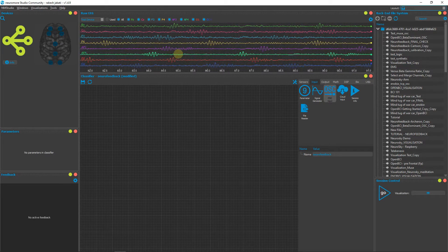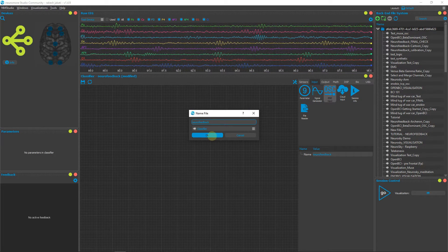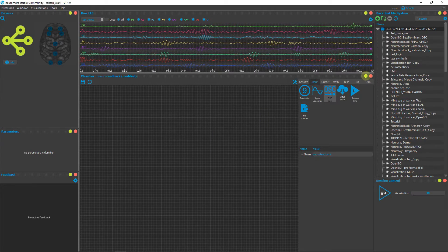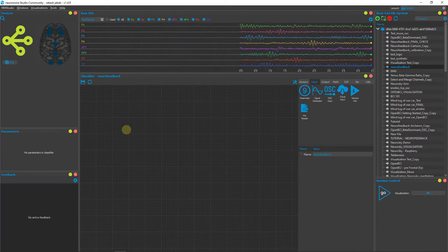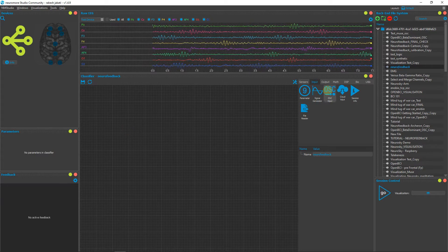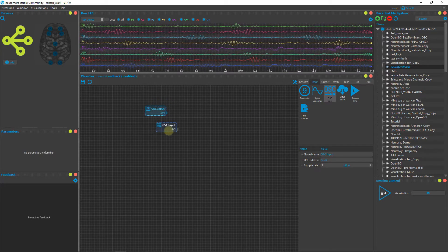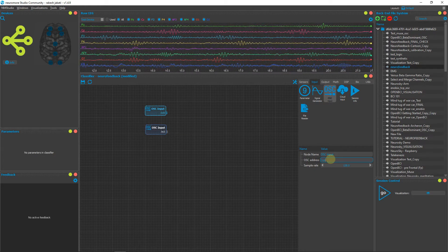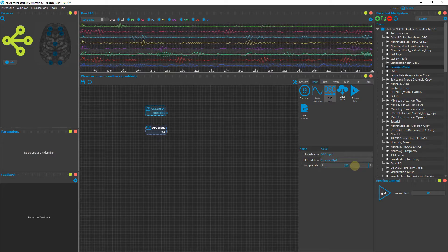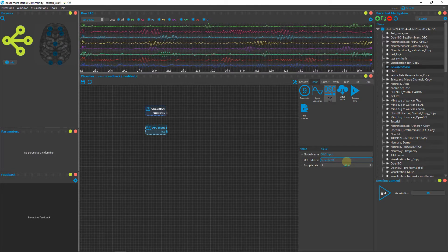To create the neurofeedback pipeline, open Neuromore Studio, right-click and create a new file called 'neurofeedback', and click OK. Open the newly created pipeline. To get data from the OpenBCI board, we use Open Sound Control — drag two OSC inputs from the input tab, as we are using two electrodes FP1 and FP2. Change the address of the first node to slash OpenBCI slash FP1 and set the sampling rate to 250. Change the second node address to OpenBCI slash FP2.